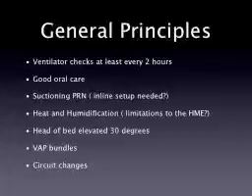And then I have this inline setup as if needed, with a question mark, and oftentimes we'll arbitrarily put in an inline setup. One very popular and common trademark setup is known as a Ballard suction unit, and that is basically an inline unit that goes in the ventilator circuit itself, and you don't have to disconnect the patient from the ventilator to suction them. This is very nice because it decreases the risk of cross-contamination, both introducing foreign contaminants into the patient and exposing the providers to contaminants from the patient. So this works both ways.